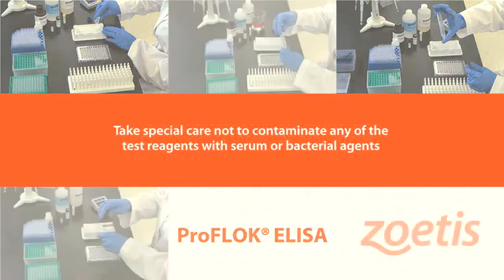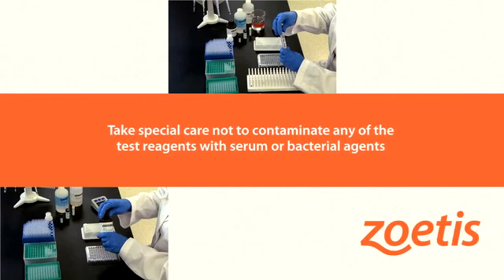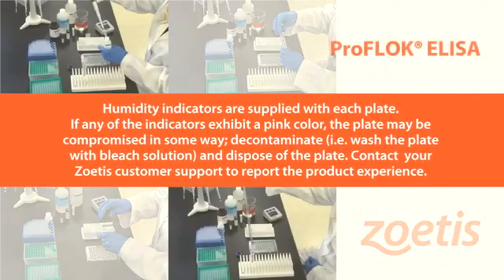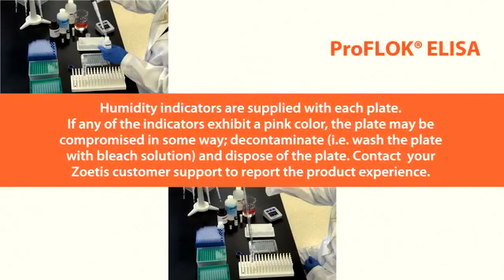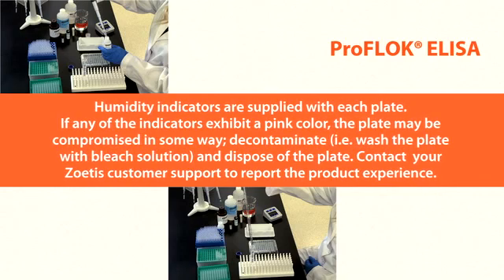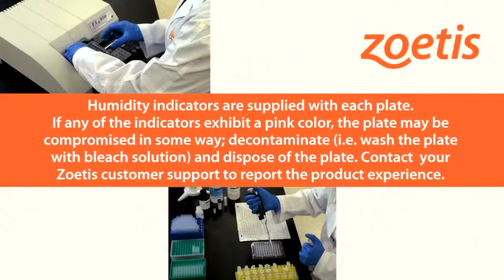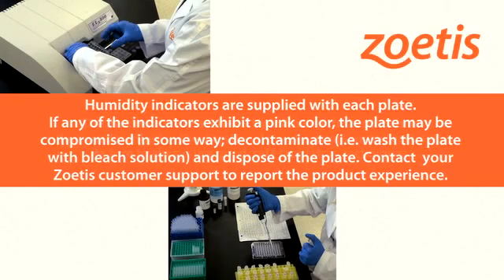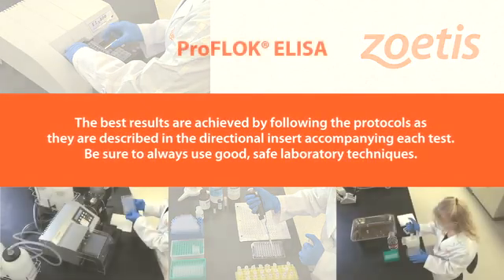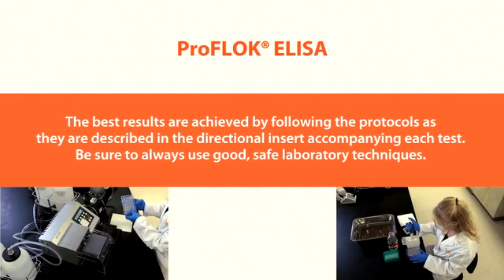Take special care not to contaminate any of the test reagents with serum or bacterial agents. Humidity indicators are supplied with each plate. If any indicator exhibits a pink color, the plate may be compromised. Decontaminate the plate with bleach solution and dispose of it. Contact your Zoetis customer support to report the product experience. The best results are achieved by following the protocols as described in the directional insert accompanying each test. Always use good, safe laboratory techniques.